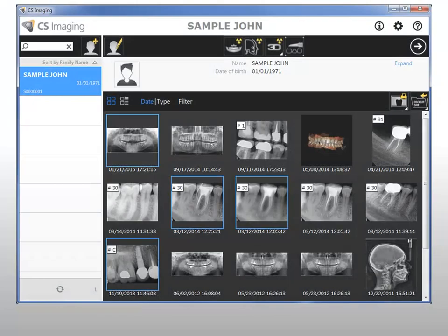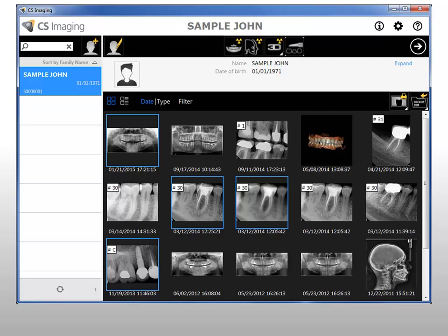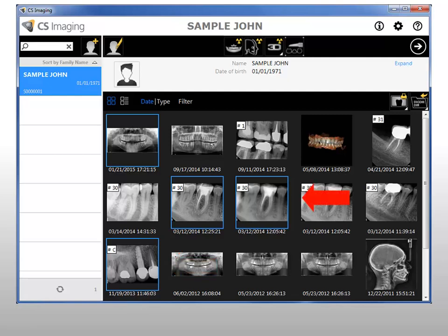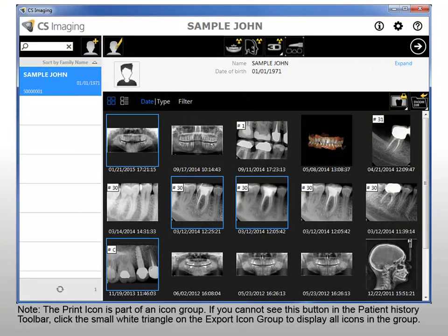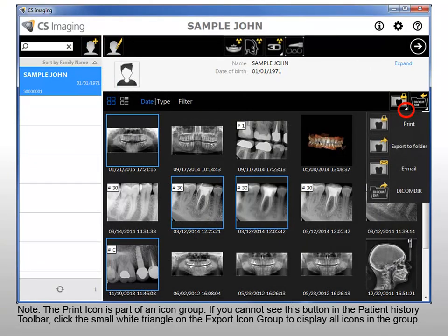Print an image. To print images from the patient browser, select the images you want to print. You can select multiple images using Ctrl-Click or click-and-drag over a group of images. In the Patient History toolbar, click Print Images. Your image selection is loaded into the CS Film Composer software. Use the CS Film Composer functions to print your image. Note, the print icon is part of an icon group. If you cannot see this button in the Patient History toolbar, click the small white triangle on the Export icon group to display all icons in the group.